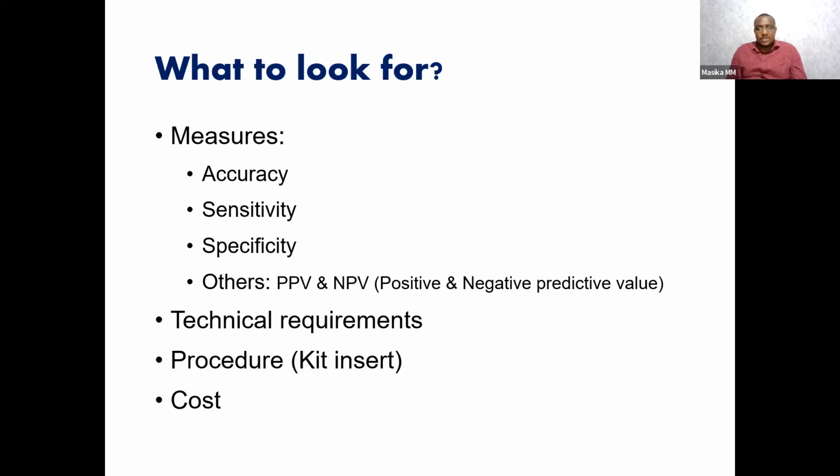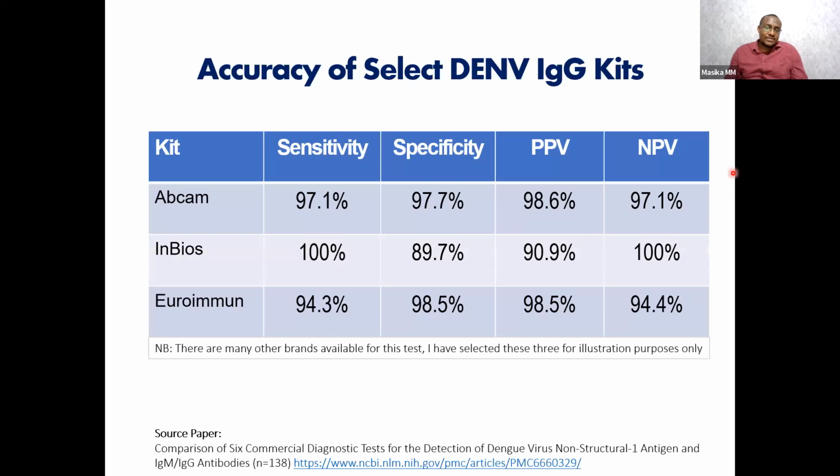So what do you do? Cost as well can be limiting. So think through those technical requirements as you read about the kit. By the time you select the kit, you have looked at these things.